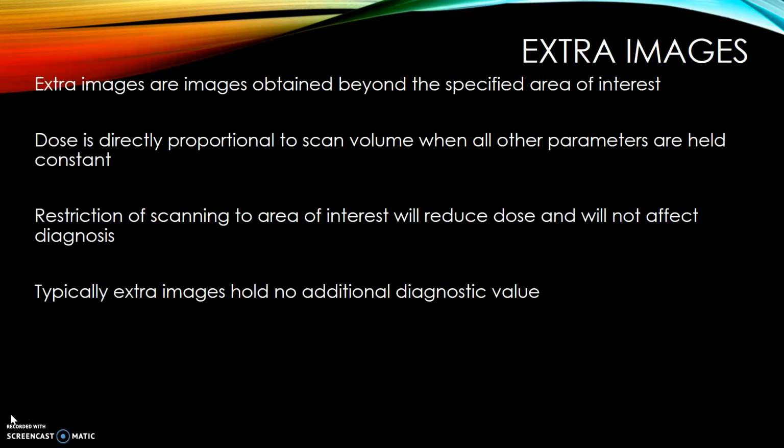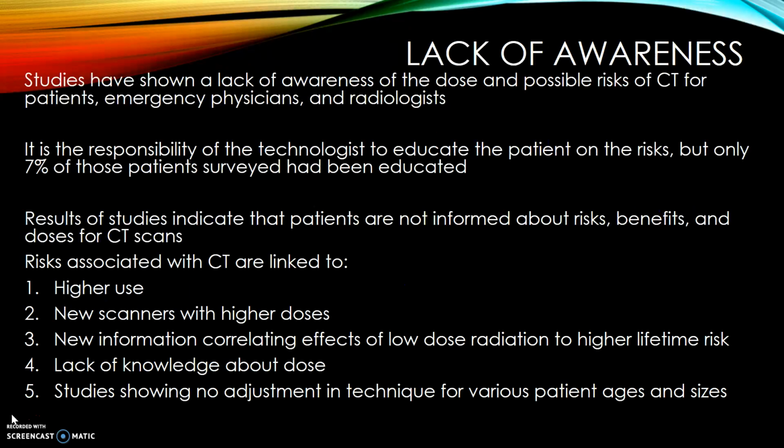Extra images are obtained beyond the specific area of interest. Dose is directly proportional to the scan volume when all other parameters are held constant. Restriction of scanning to the area of interest will reduce dose and will not affect diagnosis. Typically, extra images hold no additional diagnostic value.